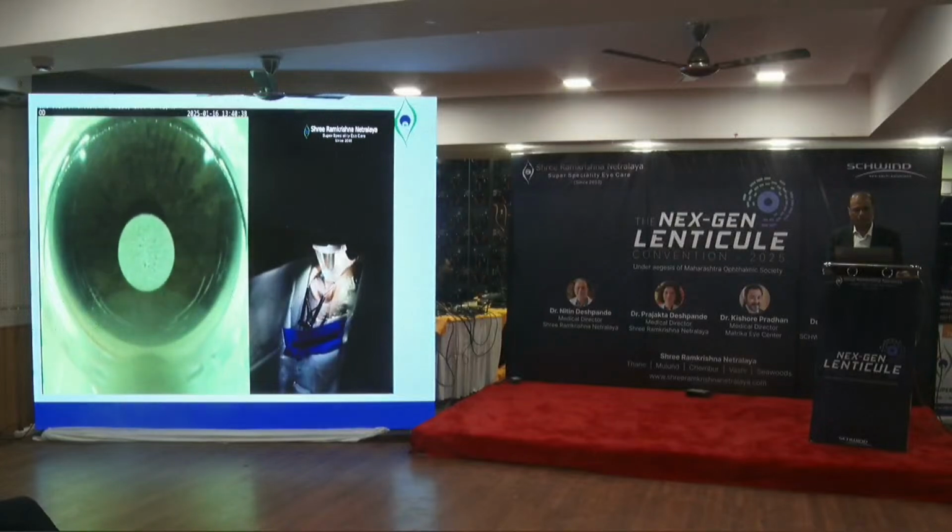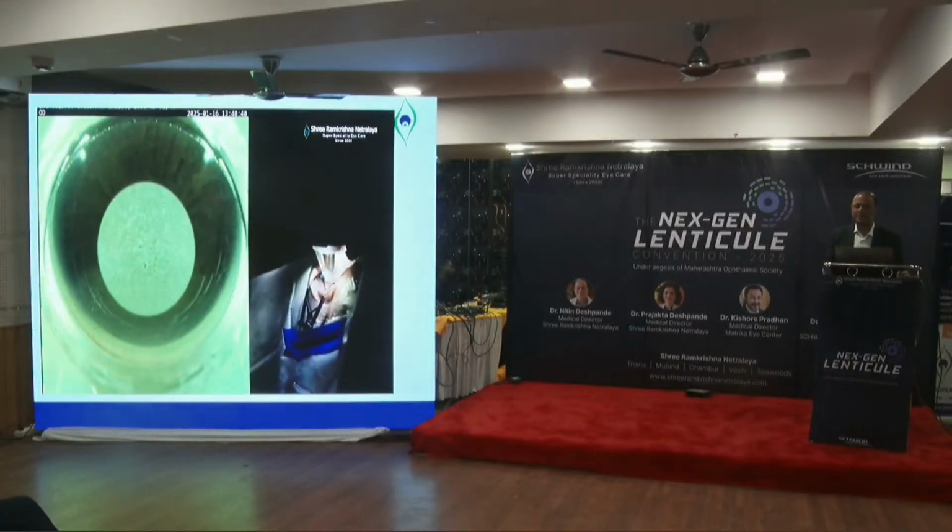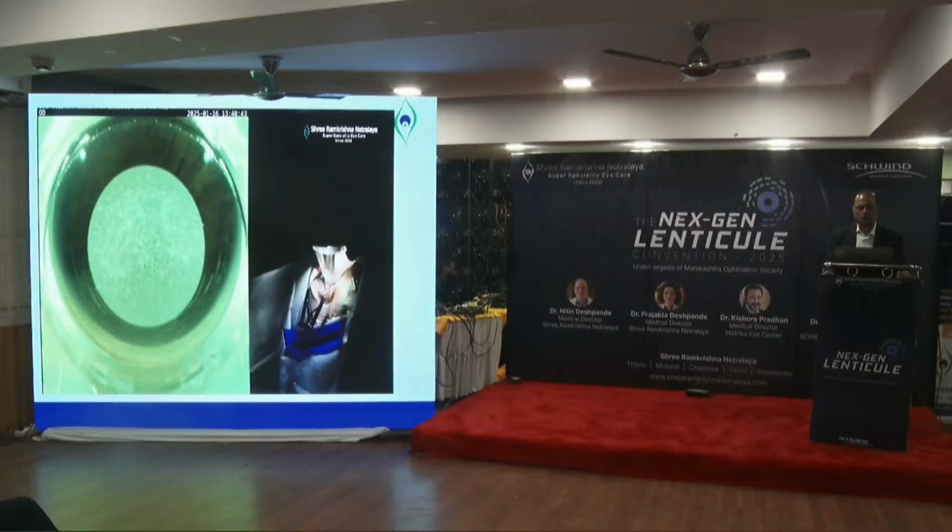Relax, completely. So you can see this has a quasi telecentric optics. It will take only a few seconds, it's going well. So you can see that little thing that is protruding into the cup, that is the laser probe, and it has a feature called quasi telecentric ablation profile, where your peripheral spots are also perfect. Because it goes close to the cornea and fires perpendicular to the cornea, you have a very uniform and a nice cut, you know. So again, this is very unique to the Atos.